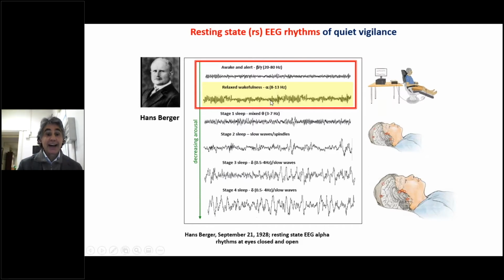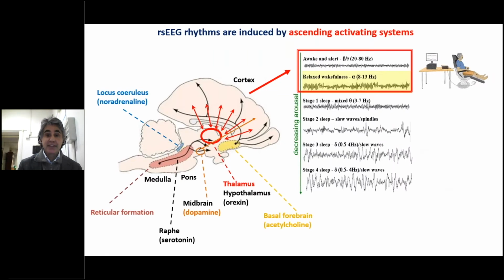in 1928. It showed ample EEG oscillations from 8 to 13 Hz on posterior areas, called alpha rhythms. These rhythms were reduced in amplitude during eyes opening and mental calculation, and you can see the appearance of higher frequencies from beta to gamma.